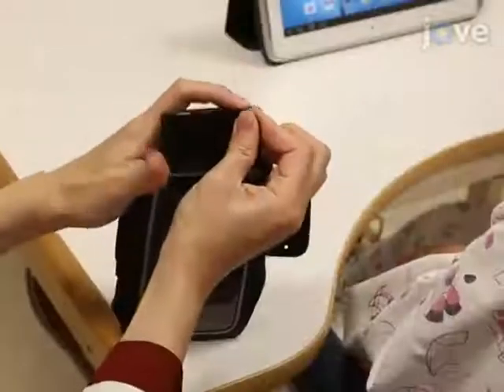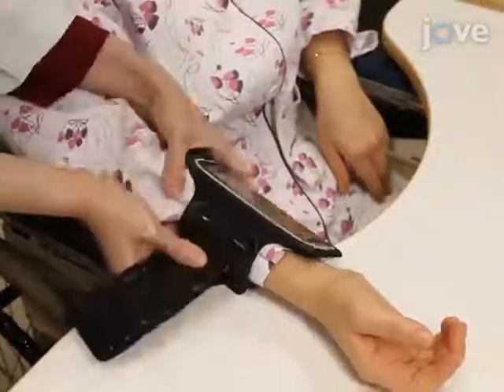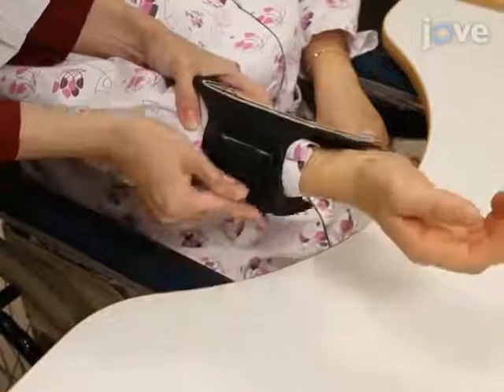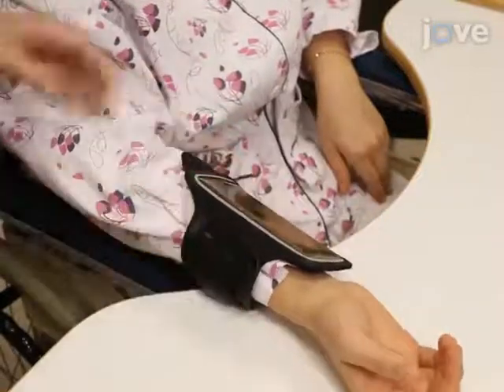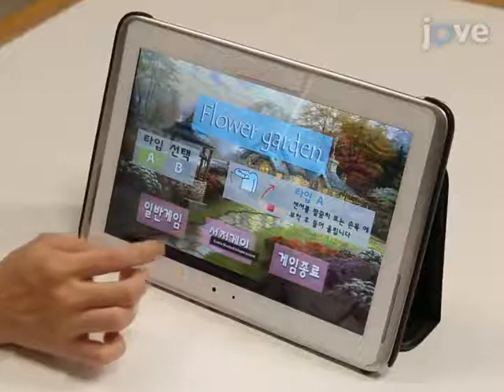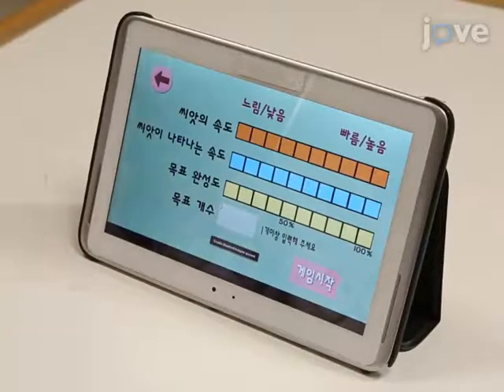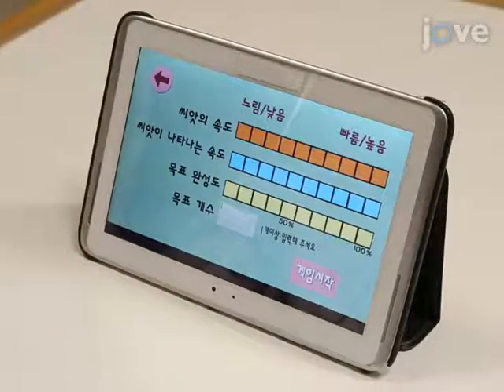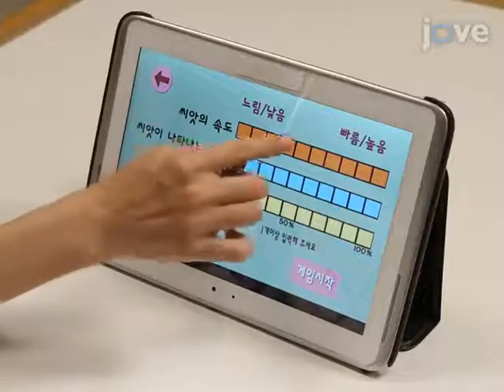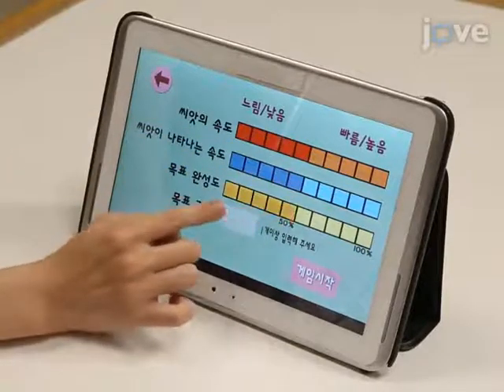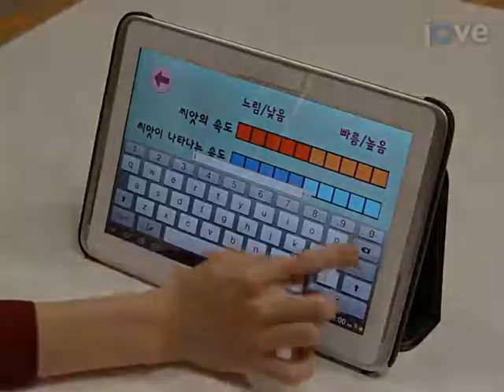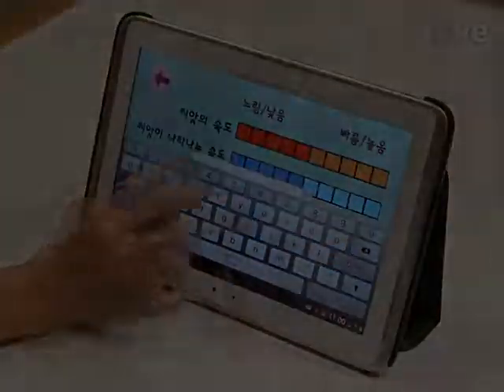Then, put the smartphone in the armband and attach the armband to the upper arm or forearm of the participant depending on the desired movement. Choose either the basic or the customized version of the game. Then, according to the participant's ability, select the game's speed, time, number of target movements, and the expected achievement of the game on the touchscreen.